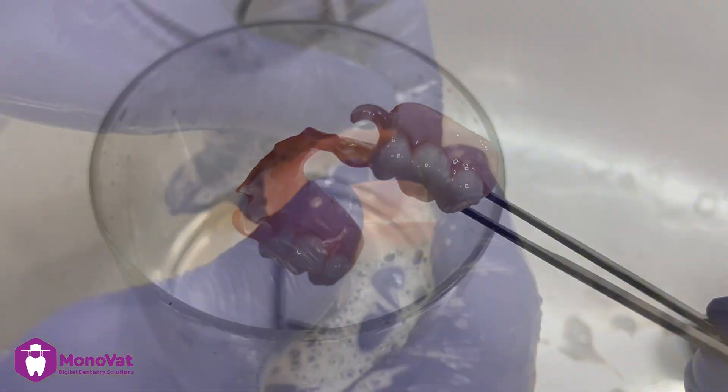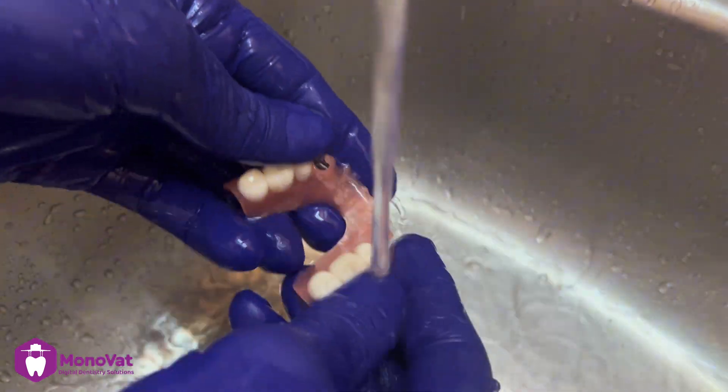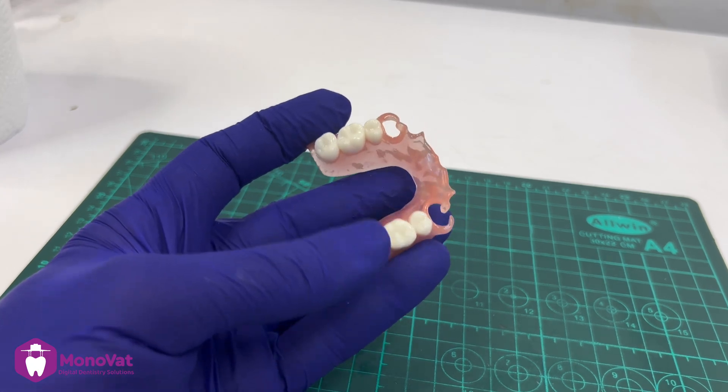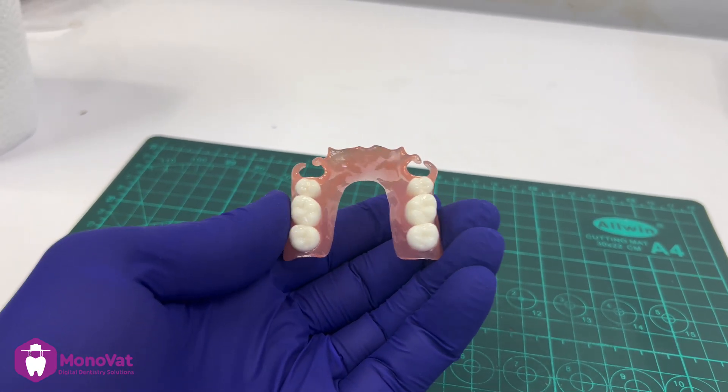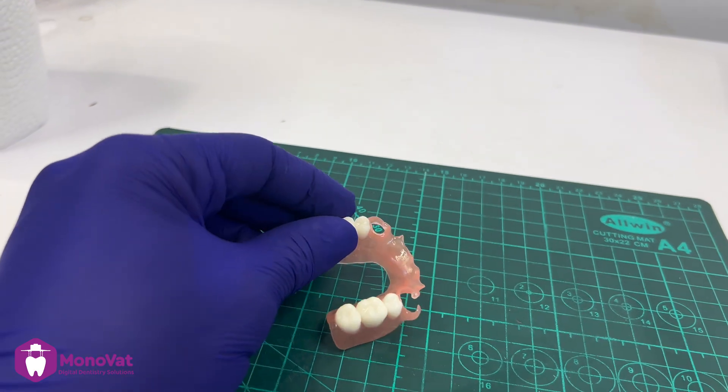After that, we can wash the denture using water and soap, and it will be ready to deliver to the patient. The candy coat gives it this shining view and protects the denture to last long.